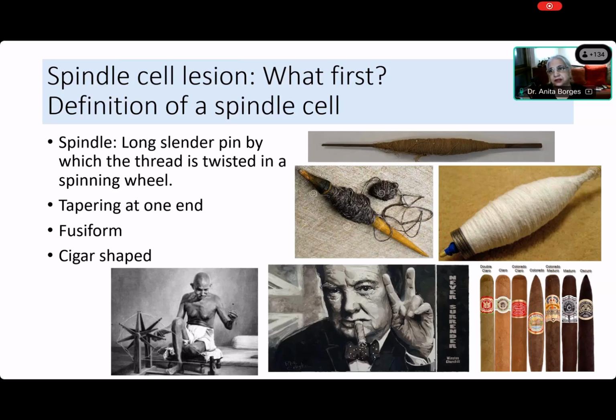Is that right, Elsa? No, ma'am. Spindle cell is elongated with the nucleus. The length of the nucleus is 2 times the breadth of the nucleus. Okay, so you believe that a spindle cell is an elongated cell which has a nucleus that is also elongated? That's what you said. Okay, good.